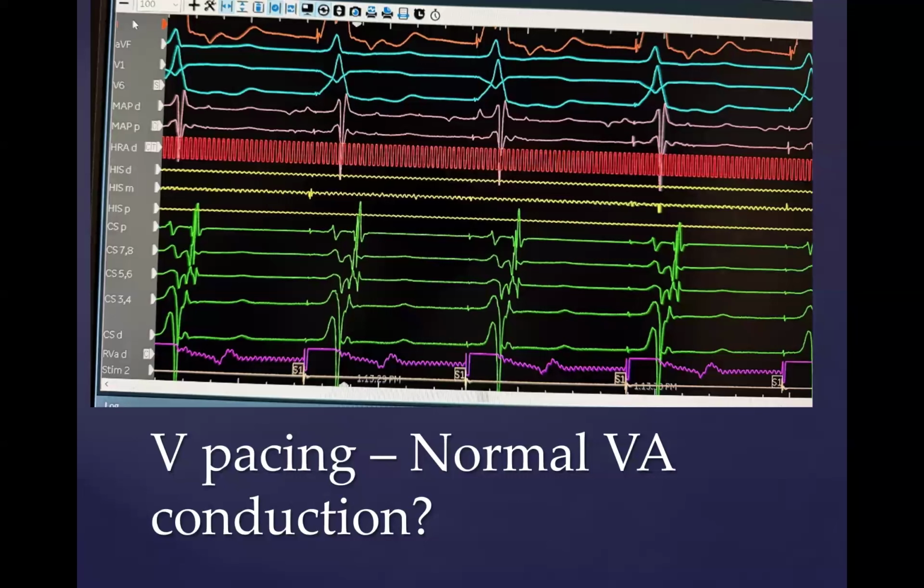And finally, I think there are two other reasons left sides are more successful. The next one is that more pathways in children are on the left side than the right side. So I think all pediatric electrophysiologists are a little more experienced at doing it, and anything you do more of, you're going to be better at. Left-sided pathways benefit from that. And then finally, because we do them transeptally, the ablation sheath or catheter is much more stable, because the septum is kind of stabilizing the back of the catheter, and it allows you to move more precisely.